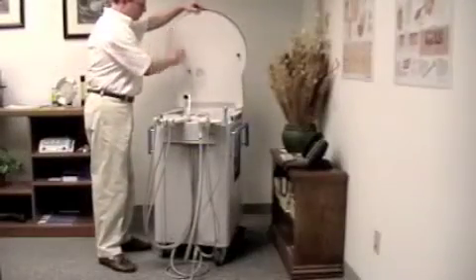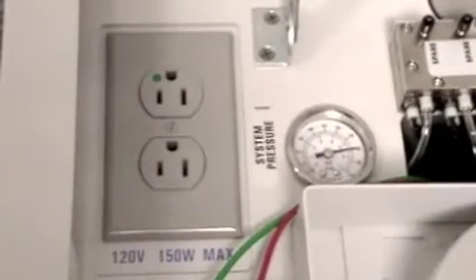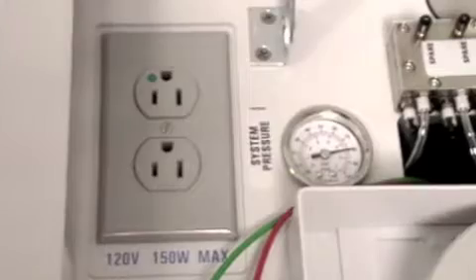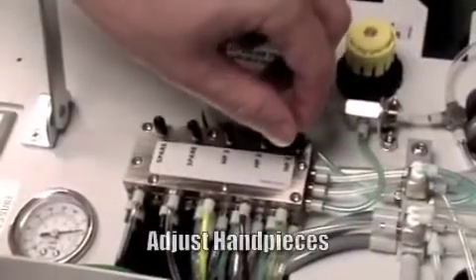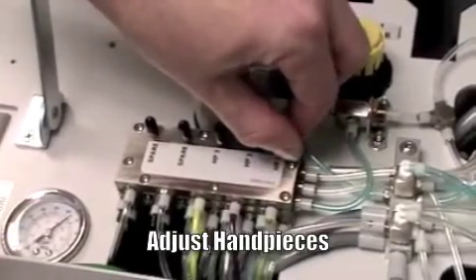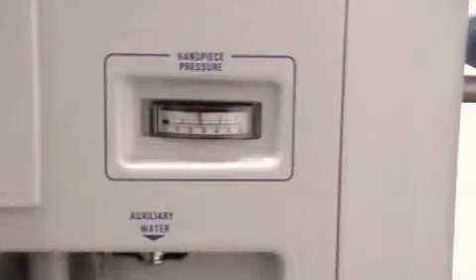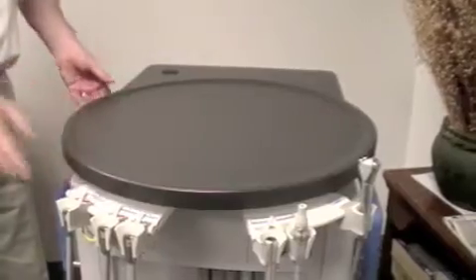Carefully lift and secure the lid to access adjustment features. The outlet is used for optional accessories such as fiber optics, curing light, and scaler. The handpiece air adjustment block is clearly labeled. Remove the desired handpiece from the holder, press the foot control, and adjust the air pressure up or down to manufacturer recommended settings. Once the desired adjustments are made, carefully press the button on the side of the support arm and gently close the lid.